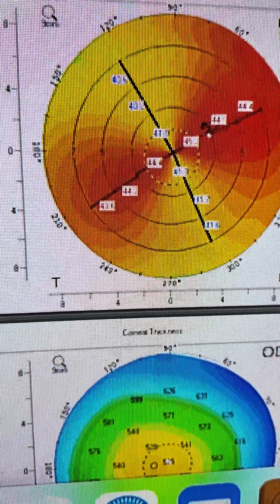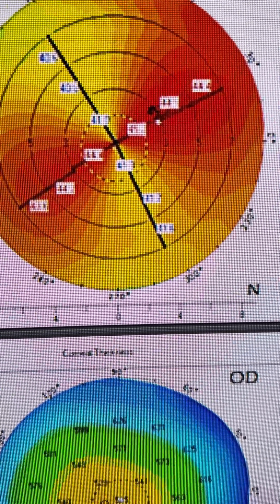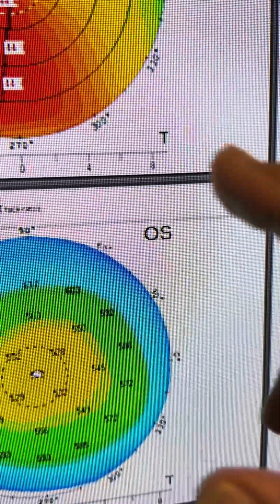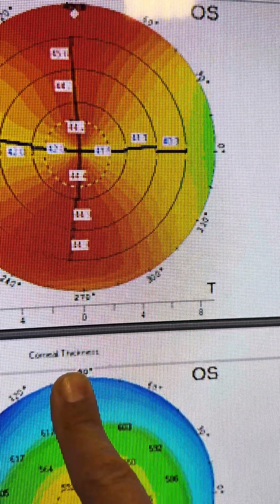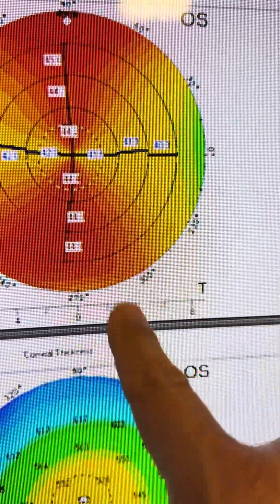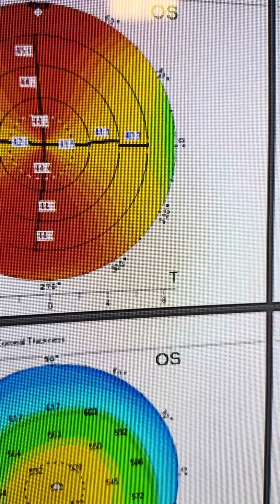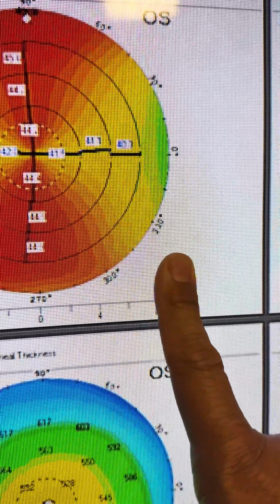Keep that in mind. Now the other eye, he's wearing plano -3 at 175 degrees, and his Pentacam in the other eye is just 2 diopters of with-the-rule astigmatism. So the axis coincides, but there is less astigmatism than what he's wearing. He's wearing 3, the Pentacam is 2.6.